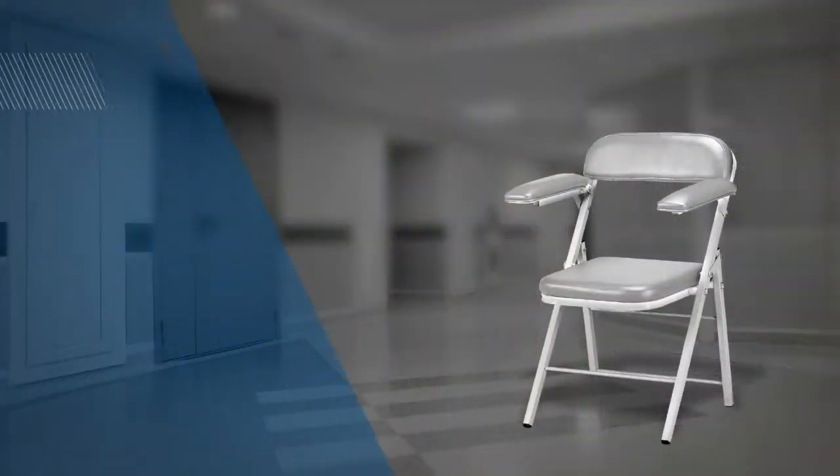Available options include a wheel transport dolly capable of carrying four chairs, a folding L-arm, and Cal 133 protection. Visit us at CustomComfort.com to learn more about our entire lineup of portable draw chairs.